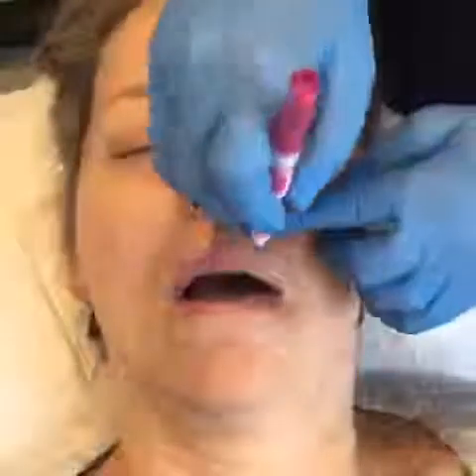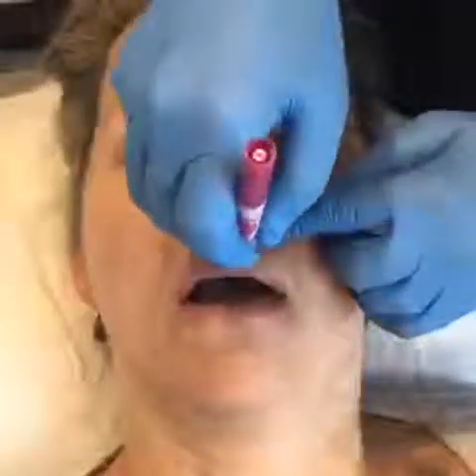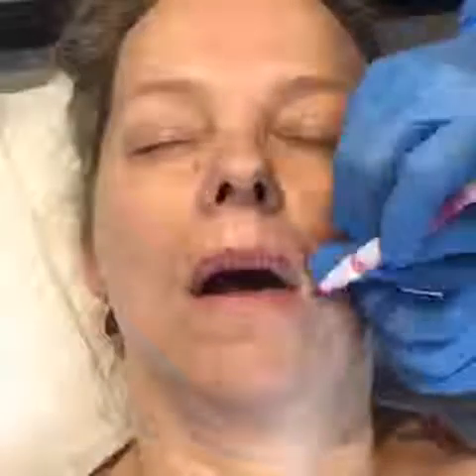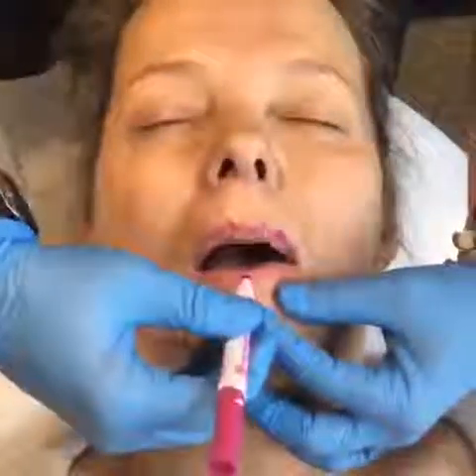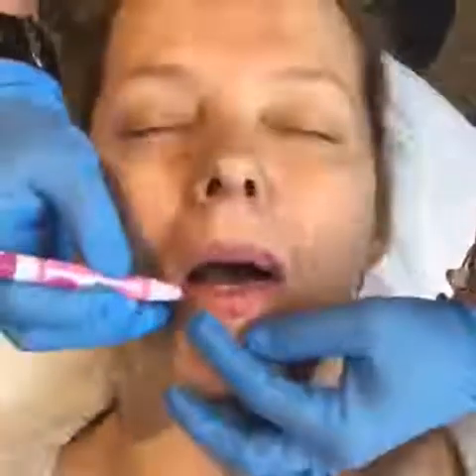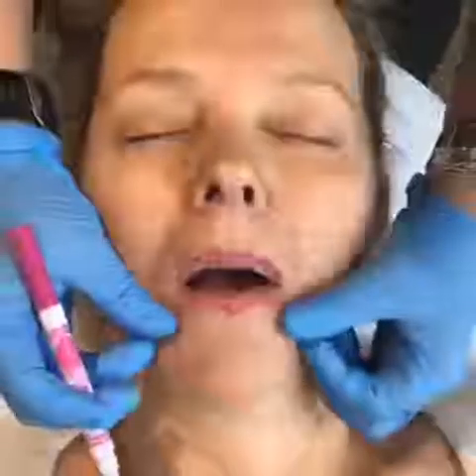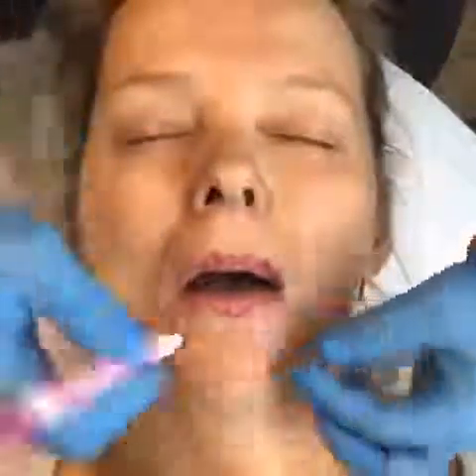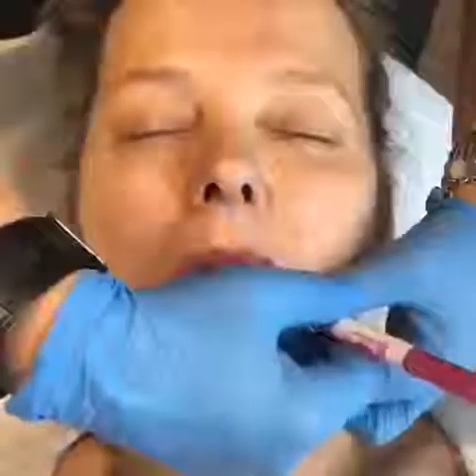So if you picture this again on the other side, you're going to have a central fan, a fan that you now landmark down the side of the lip, and then a little V. And on the bottom, I do the same thing. I do a central fan, where I'm giving less centrally and more on either side of midline, because that's where my tubercles need to be. I'm also going to give her some laterally because I want the lip to be in proper proportion to the rest of her face.